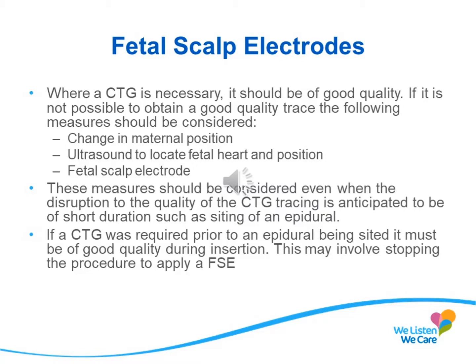Even if you think the CTG loss of contact will only be short-lived, for example when an epidural has been sited, it's really important that these measures are considered and that every effort is made to resolve any loss of contact. For example, if you're unable to monitor while an epidural is being sited, then you should pause the siting, apply an FSE, and then start again.